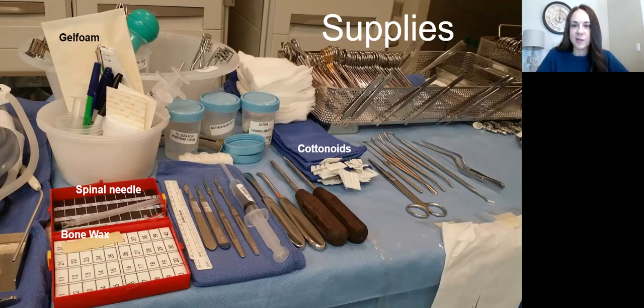I think that's most of the supplies I see on here actually. So let's look at your book, Routine Supplies, 1134. So lots of cottonoids. Bovie and bipolar, cotton balls, where it says cotton balls.